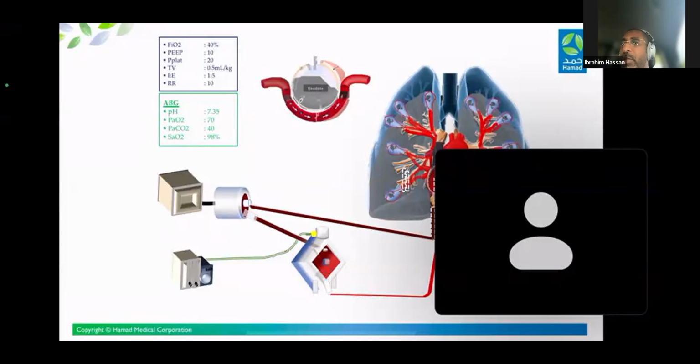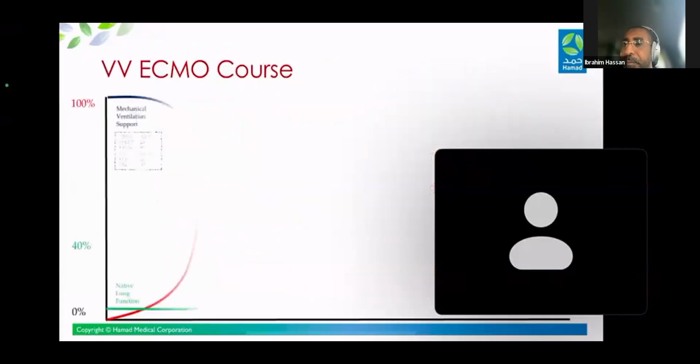But you need to pick your patient who will benefit from this treatment. These are the patients that I think, in my view, are refractory hypoxemia that is prone resistant or have contraindication to prone, and you cannot achieve protective ventilation with the very, very severe lung injury score.